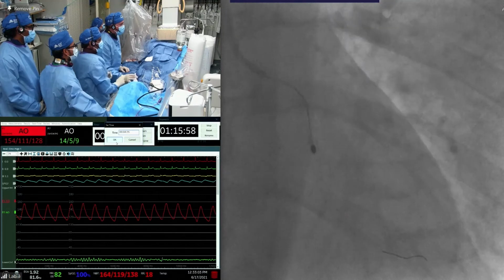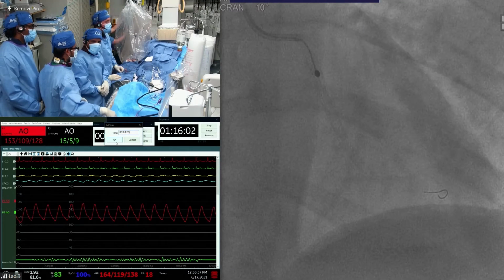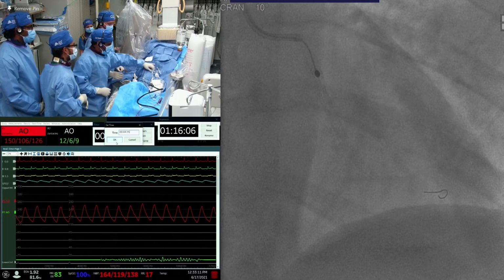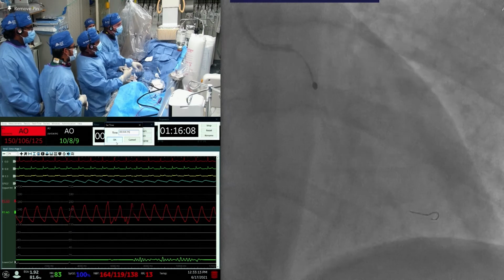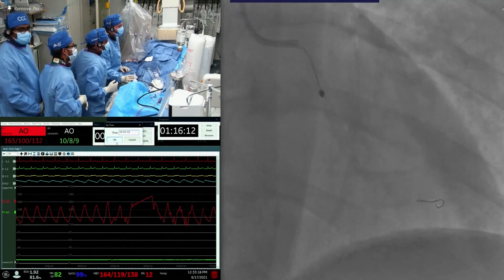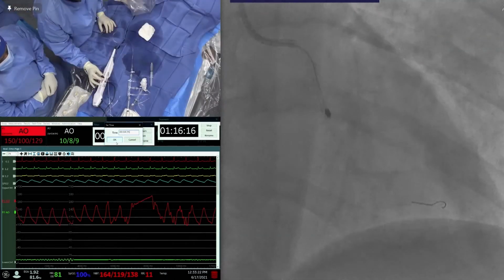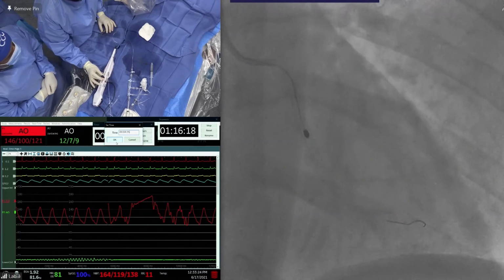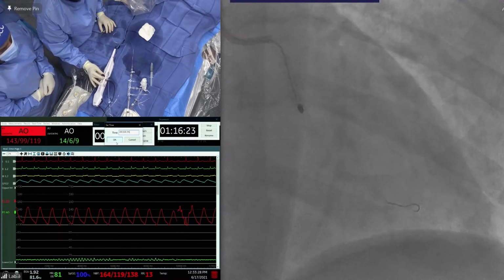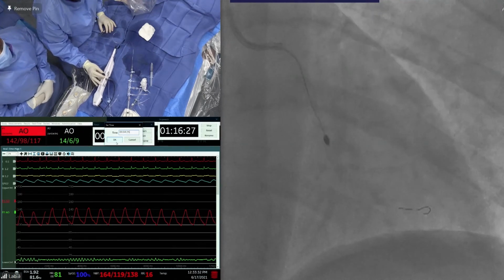But what I'm seeing is you have to be patient here because there's calcium, it's a lot of disease. If you see some decel, you want to go slow and steady, which is what they're doing. Why a 2.0 burr in the beginning? Can we do a 1.5 burr and upsize? I think that's what Dr. Sharma was talking about. Maybe 1.75 and then go to a 2.25 or 2.0. But yeah, because the result was so good, that was the only lesion.